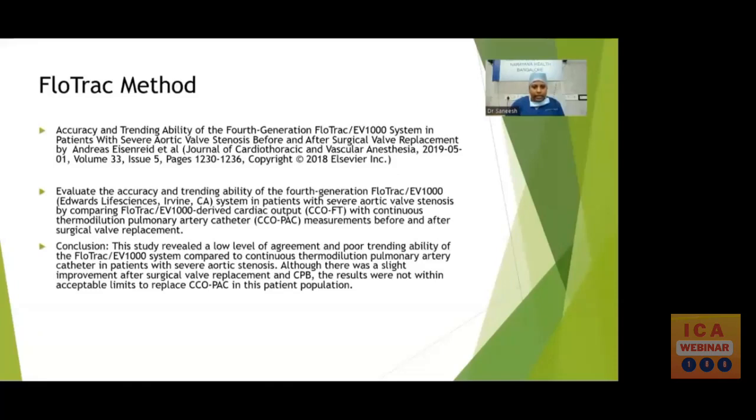According to a study conducted by Andreas et al., they evaluated the accuracy and trending ability of fourth-generation FloTrac and cardiac output monitoring by thermodilution pulmonary artery catheter measurements in patients with severe aortic valve stenosis. They evaluated cardiac output before and after the surgical valve replacement. In their study, it showed that there was a low level of agreement and poor trending ability of FloTrac compared to continuous thermodilution pulmonary artery catheter in patients with severe aortic stenosis. Although there was a slight improvement after surgical valve replacement and cardiopulmonary bypass, the results were not within acceptable limits to replace continuous cardiac output monitoring by PA catheter in this patient population.